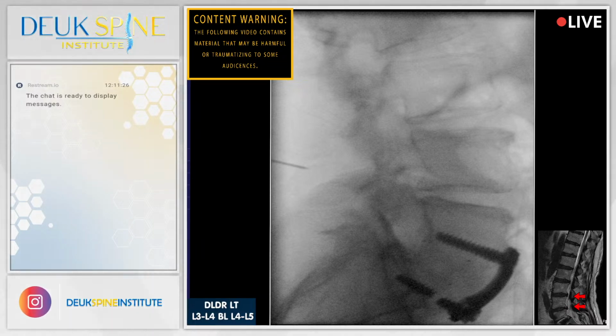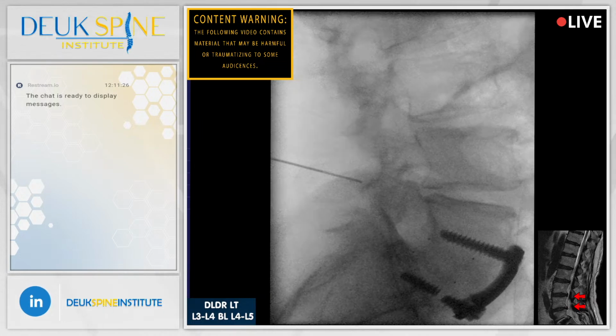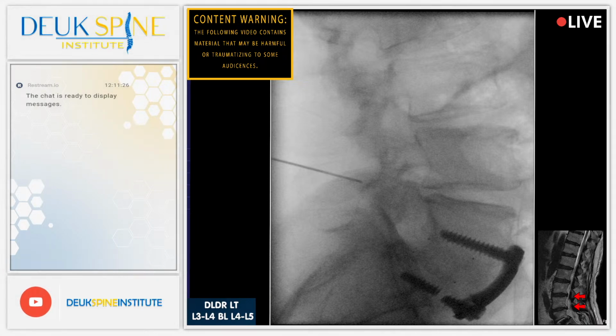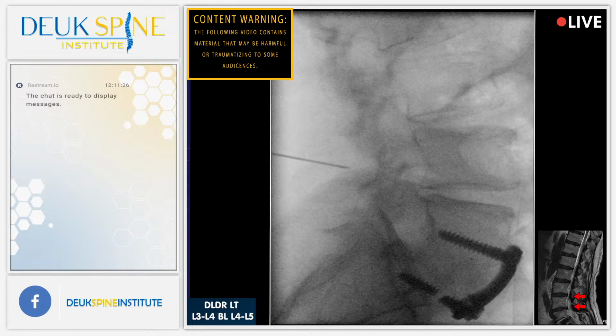Or next facet joint. Shot? And that's why the patient is here, to have his adjacent discs that are damaged and causing pain in his back and his legs. He's here to have those addressed. Shot? All right. So I'm aiming for the L4-5 shot. And he's wonderfully patient with me. Shot.